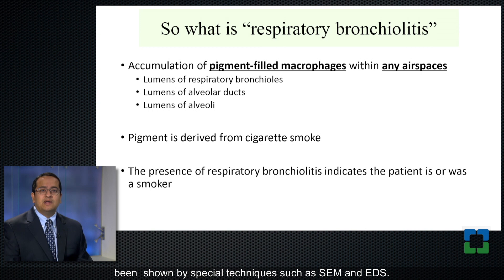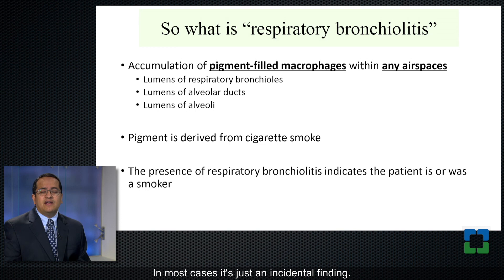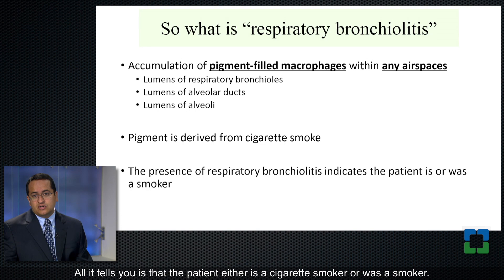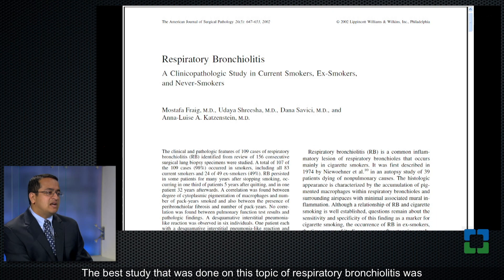What's the significance of this finding? In most cases, it's just an incidental finding. All it tells you is that the patient either is a cigarette smoker or was a smoker — that's all the information that you get from this finding in the lung.